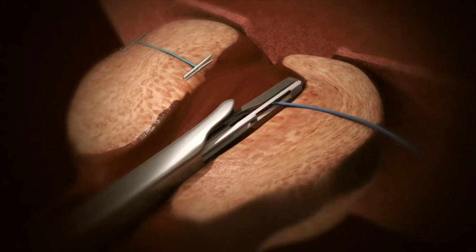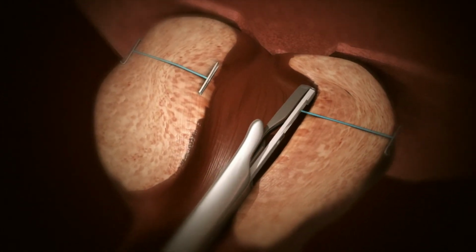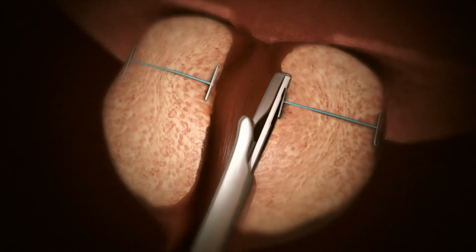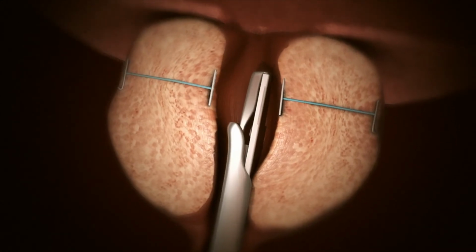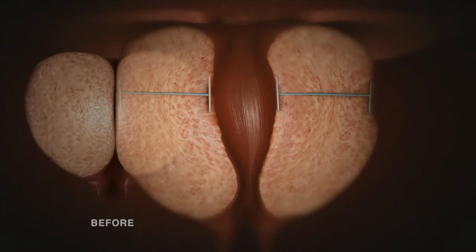Urolift actually just got approval for large glands. Urolift has some true benefits as well, in that the procedure is done quickly, just like Rezum and iTind. The procedure involves these clips that are put into the prostate. It kind of stretches the opening, and that opening is a passageway between the bladder and the urethra. The bigger your prostate gets, the more clips that are involved.